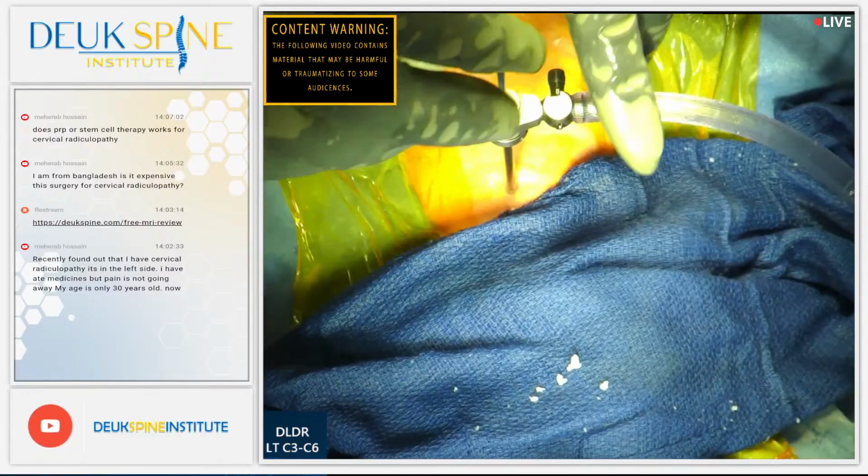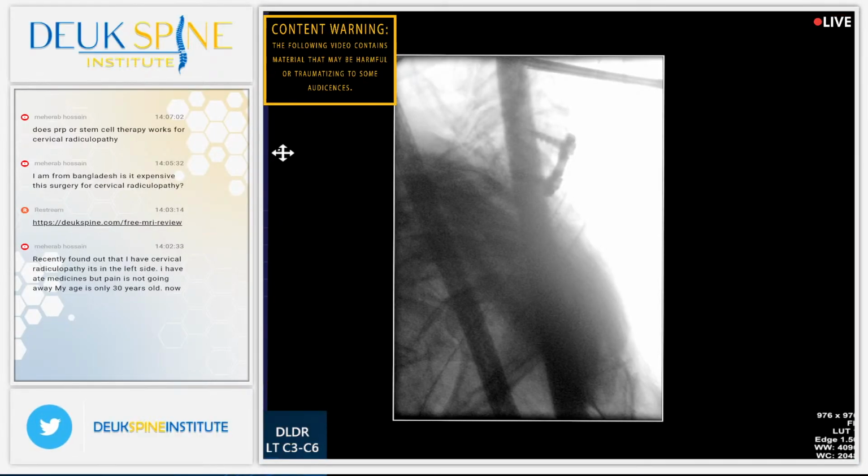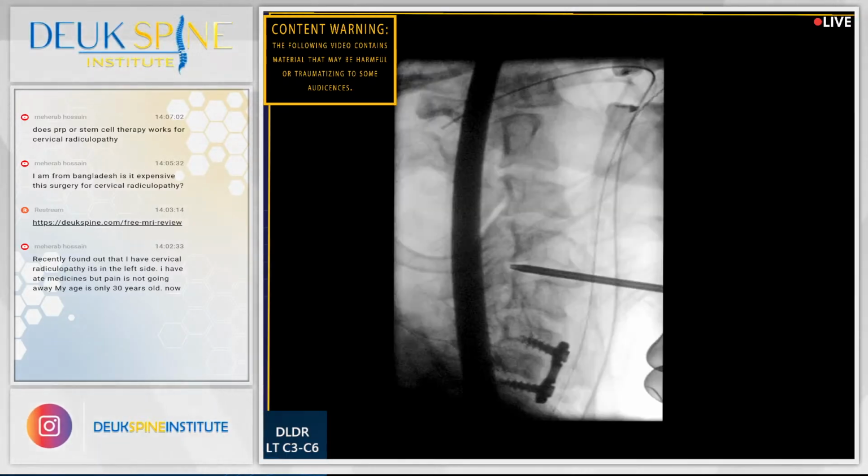All right. Shot. Shot. Good. I'm removing the tube. Tube is out. I'm holding the dilator in place. Luis will take control of the tube. Shot. All right, tube's out.